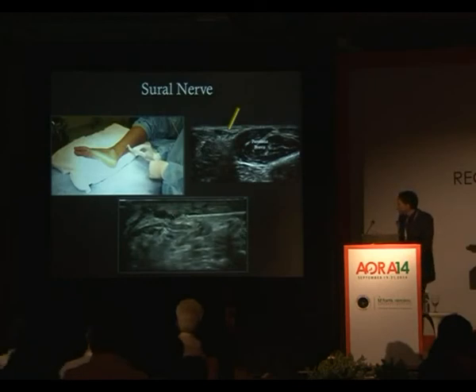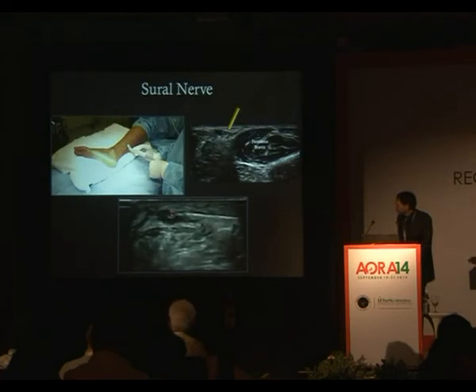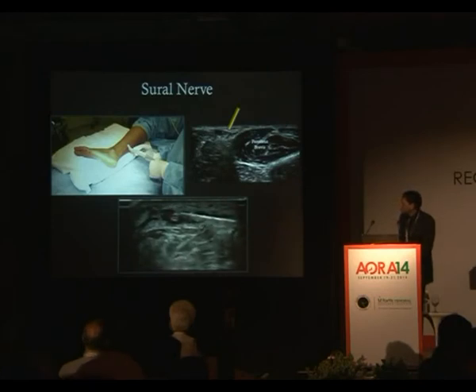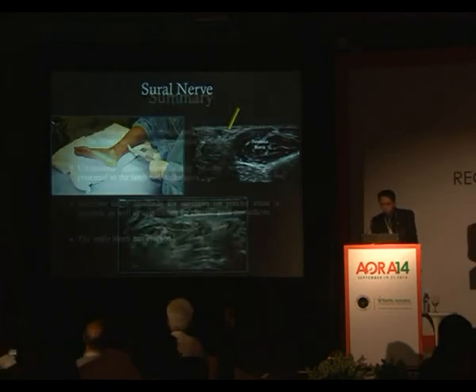You can see the injection here, and look closely over here. This is the vein. And this is the nerve right over here. You can see a well-defined round structure there. That's the sural nerve.